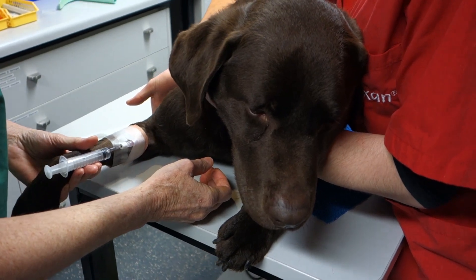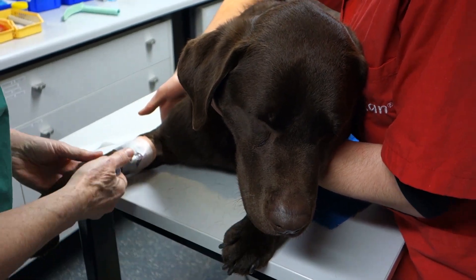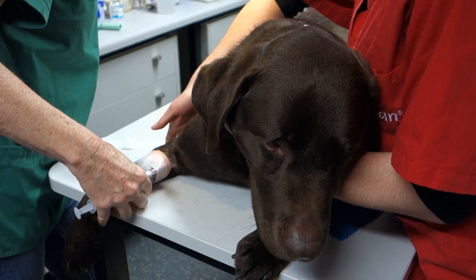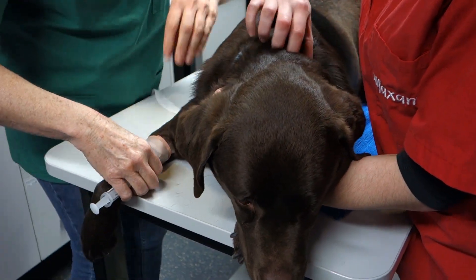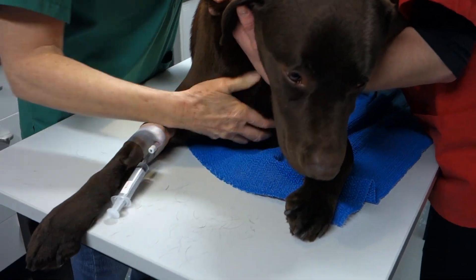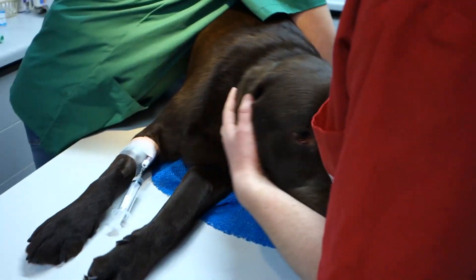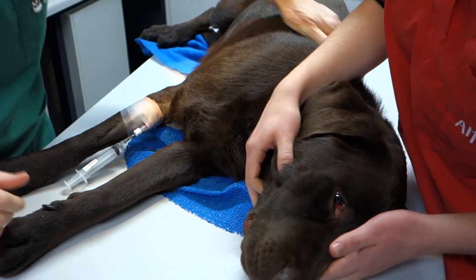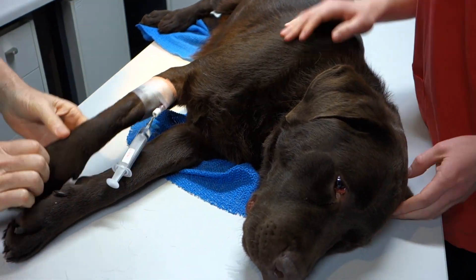He'll be losing his righting reflex, which means that he'll want to fall down — he won't want to sit up. He's a big boy, so we'll have to move him back on the table so we can get his whole body on the table. His left-hand side. Now, we need to make sure that we're not going to get bitten.